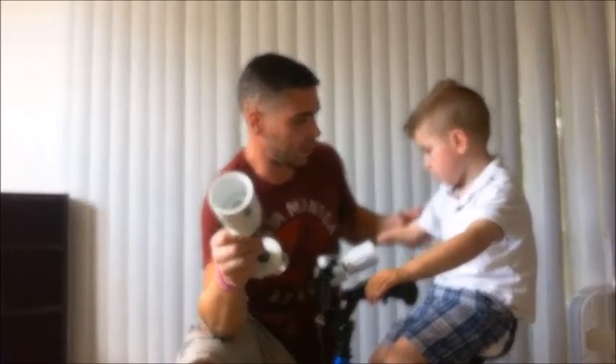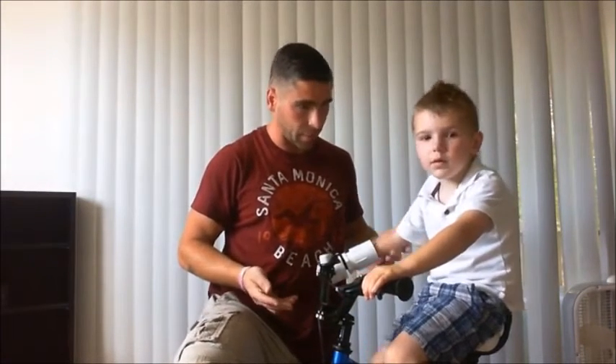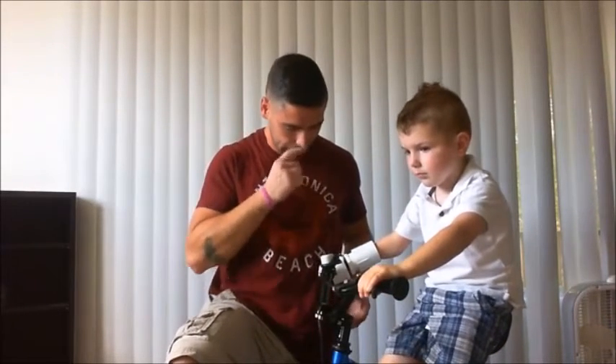This is another version I was playing around with — it's obviously bigger and longer, so this would be for a bigger person who doesn't have the arm length that Carter has. This was the solution we came up with and we're really happy with it. He's been riding his bike to the parking lot all by himself. And it was cheap — under 20 bucks for all the parts. The Dremel tools are a little more expensive, but the first one I made I just used a grinder and a drill bit for the notch and the slit. It wasn't pretty, but it worked and Carter was able to use it.